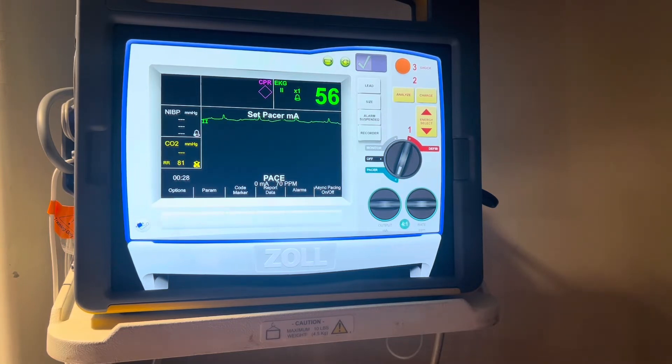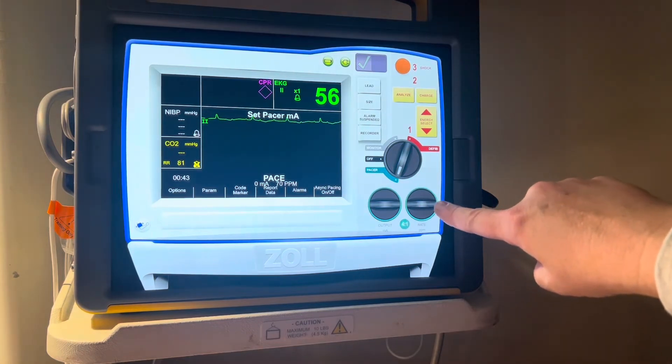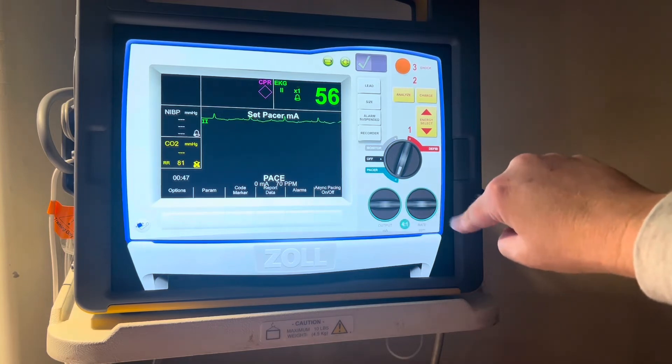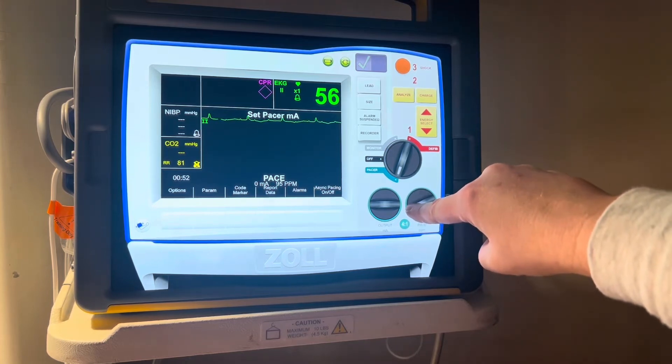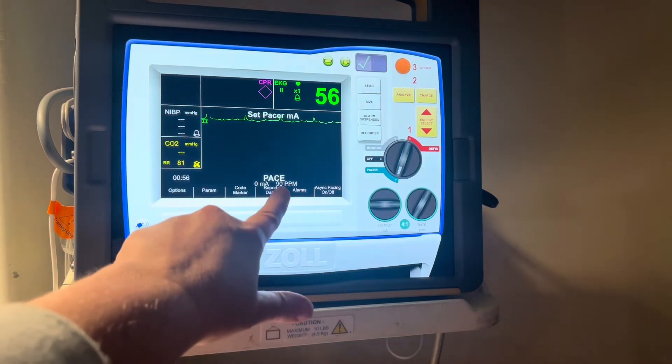If you'll notice, this patient has been at a heart rate of 56, so it may be in the patient's best interest to keep the heart rate between 80 or 90. For the purpose of this video, we're going to increase our rate to 90. You do this by choosing the bottom two dials — the rate is located here on the right — and you turn that dial to a rate of 90, which you can see right here at the bottom.